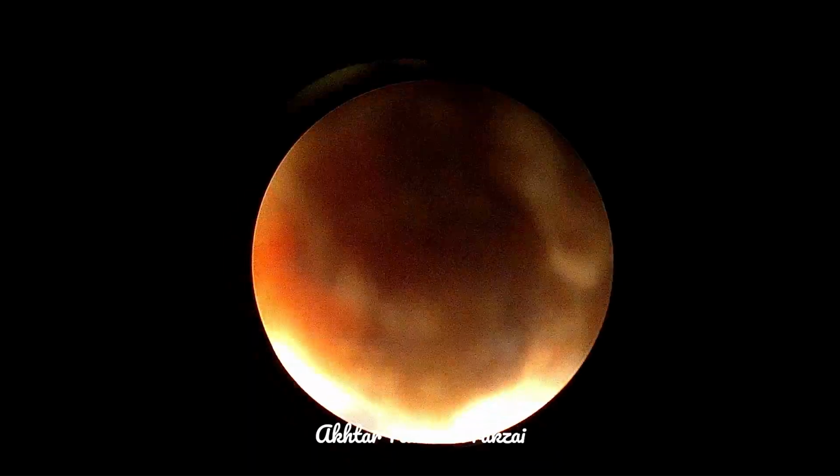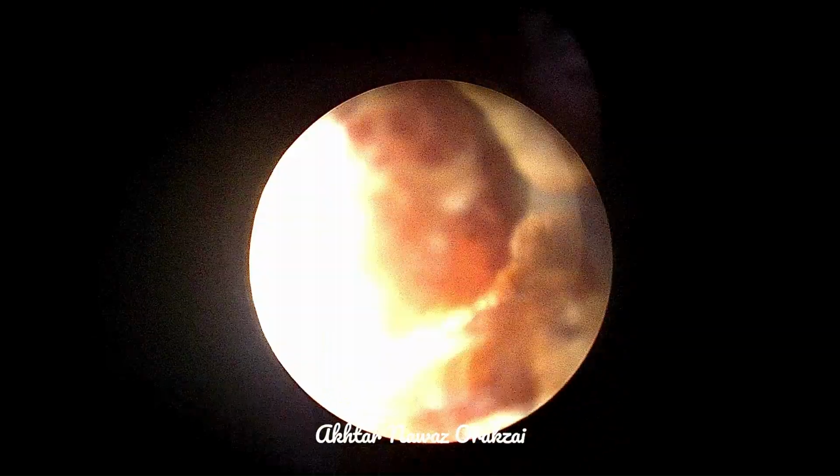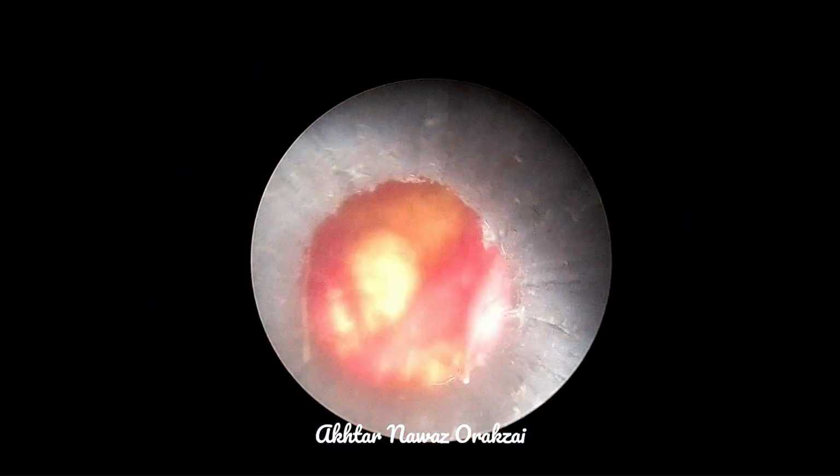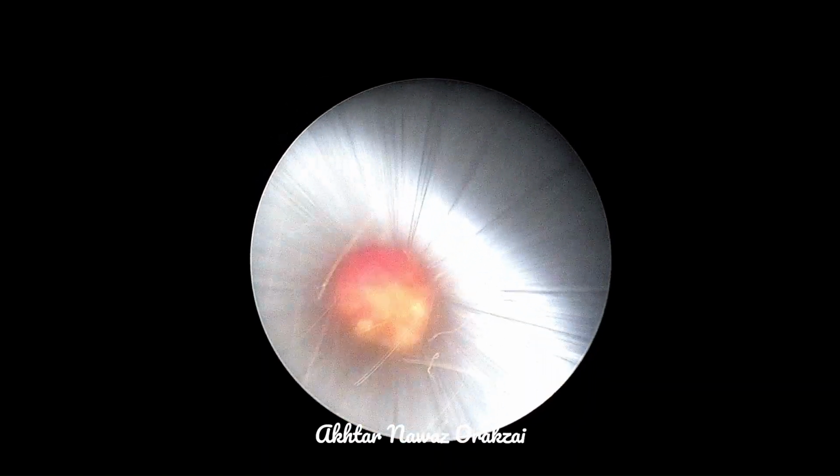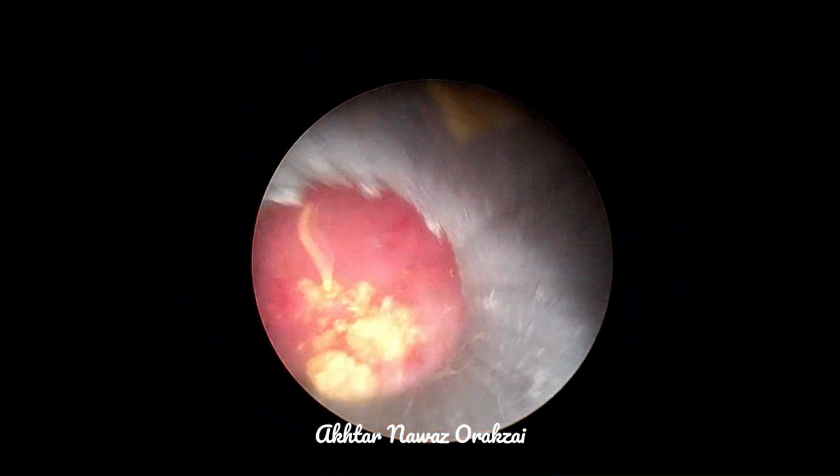Here we are not using the forceps, as you can see. The simple wash from below, perurethral through the catheter, is pushing all the stones through the suprapubic route outside the bladder, because they are so small and there are so many that going in and taking them out one by one would take all day. Anyways, this procedure took us around 1.5 hours, and that was because of the hardness of the stone.